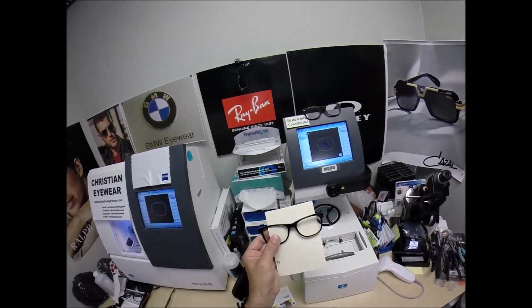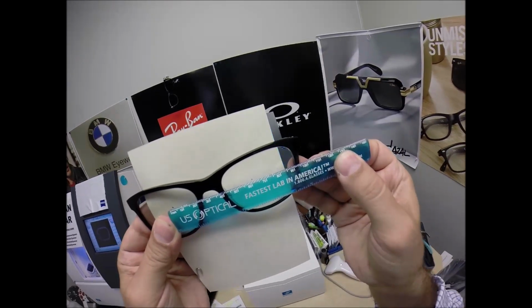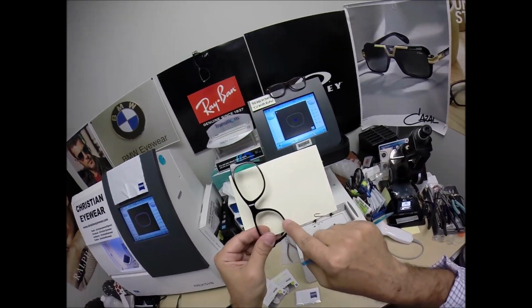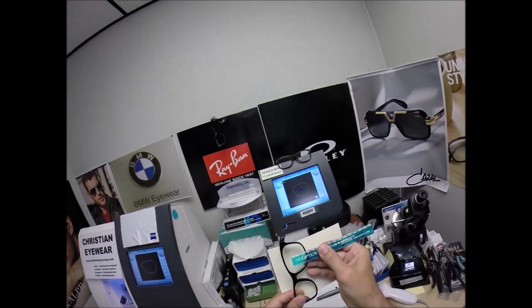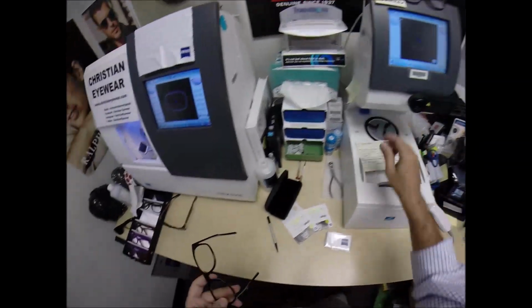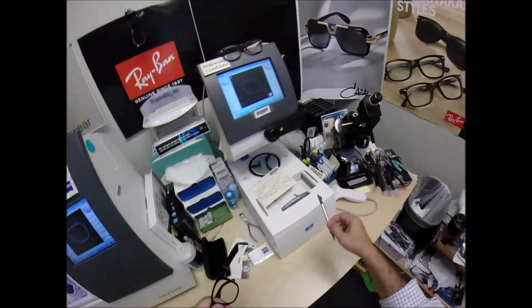Place the PD stick against my thumb. When we hold it up to the left lens, we're getting 61 millimeters, so that is cut perfectly. Now, not to the bottom of the lens, but to the thickest part of the plastic at the deepest part of the frame. And we're at 24 millimeters, so that is cut perfectly. Now, the last thing I do is I get the frame in a 3-point stance.